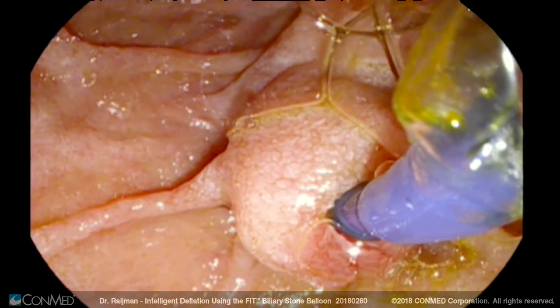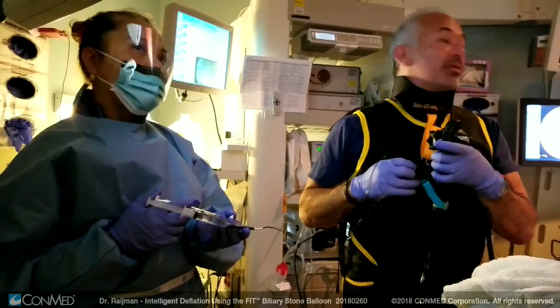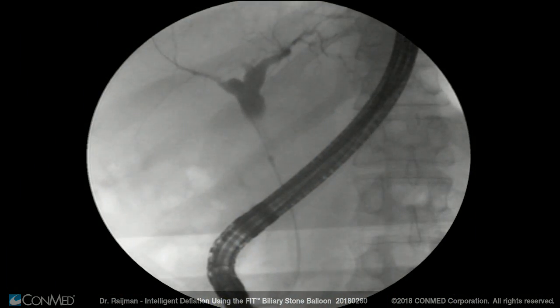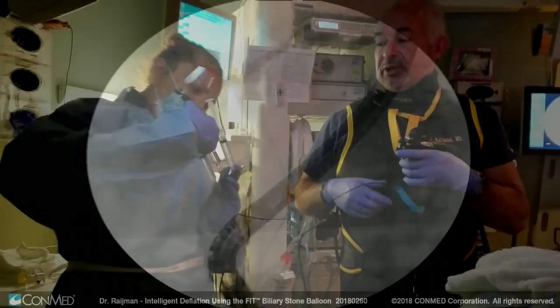The balloon usually tends to come out in the lower part of the ampulla, so it is just a matter of bringing the ampulla toward me by adjusting the dials of the duodenoscope, and then inflating the balloon with one cc.